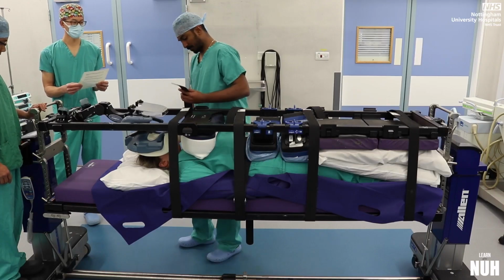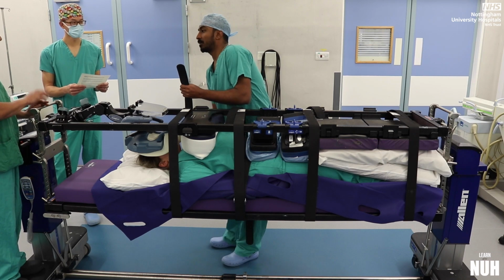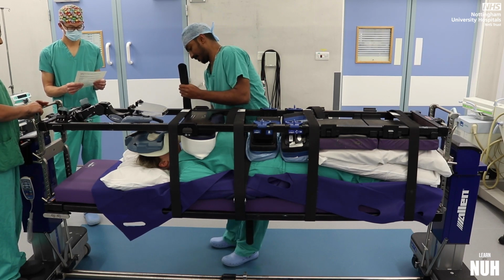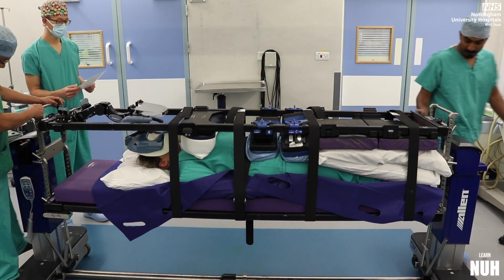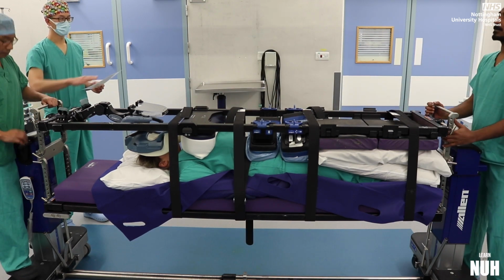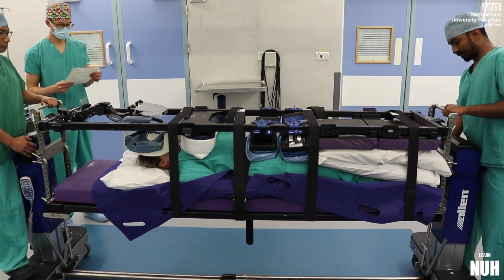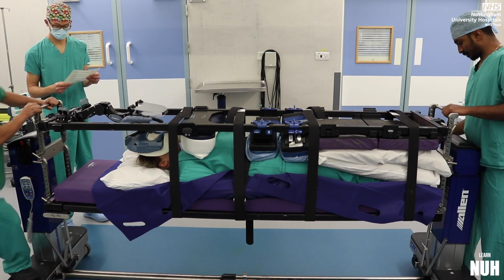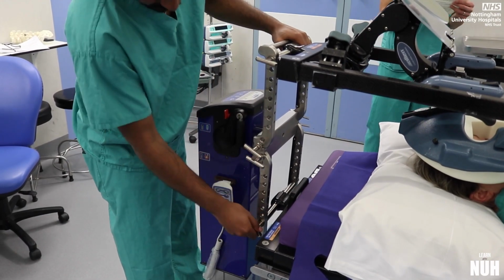When ready to prone the patient, identify who will lead the flip and who will perform the flip. Identify which direction the flip will occur. Generally, the arm with the IV access will go over the top of the Allen table, so a left arm IV access will go over to the right. Check, are all the 8 pins inserted?